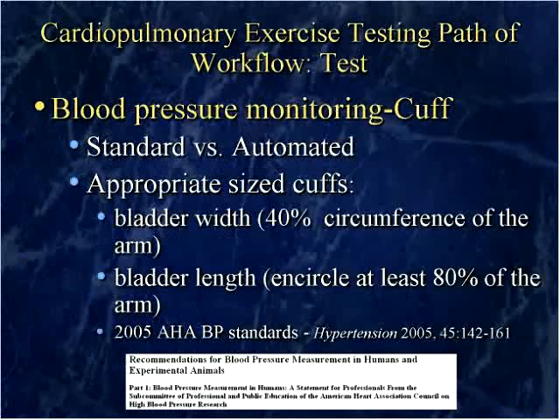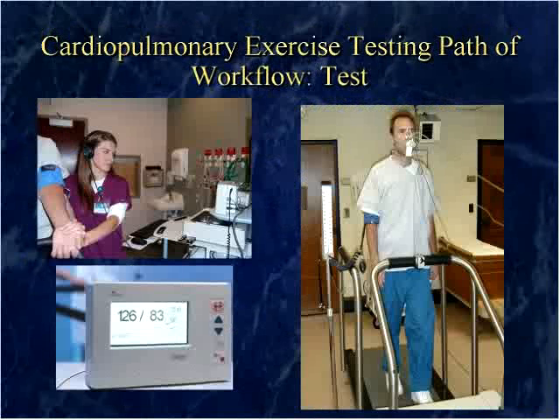You inflate the cuff and listen for the Korotkoff sounds, and you end up with bouncing as they run along a treadmill, and or some type of interference even when cycling if you don't cradle the arm a little bit. Standard and automated cuffs, you can use either of those. The automated cuffs, there are specific devices, and I'm not a champion of talking about specific devices, but there are devices that are automated that interact with ECG signal and sound processing and everything else that allows you to use these devices during exercise testing.